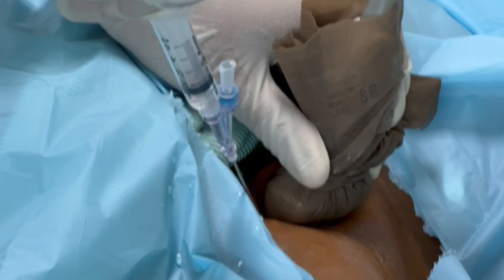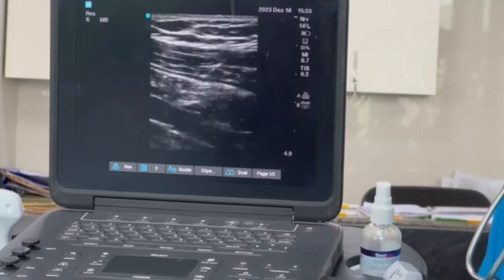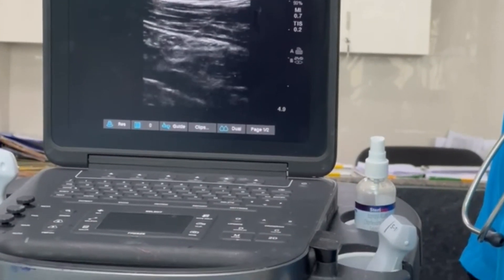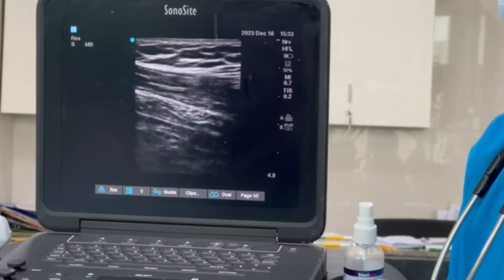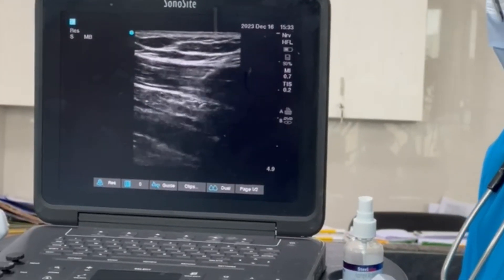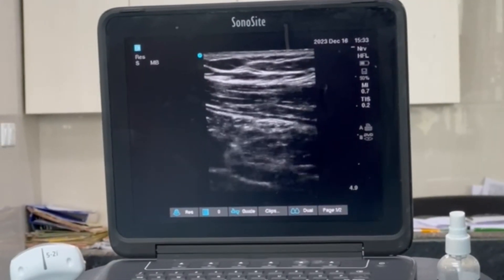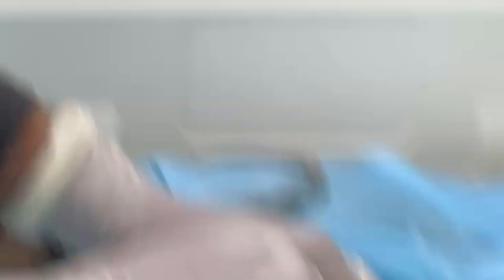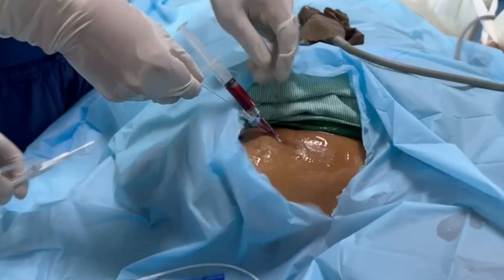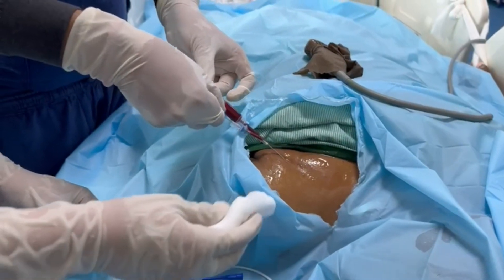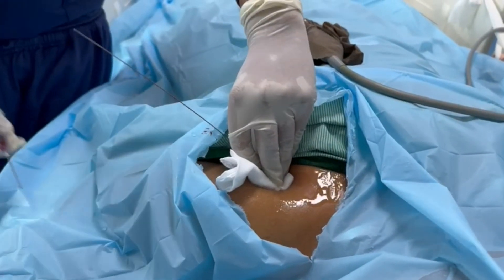After getting the longitudinal view of the subclavian vein, take the puncture through the inline technique. As you can see, the needle is going to puncture the subclavian vein. Pectoralis major and minor muscles are also visible over the subclavian vein. Once you puncture the subclavian vein you will get a pop — a loss-of-resistance feeling. Then introduce the guidewire through the side port of the needle.